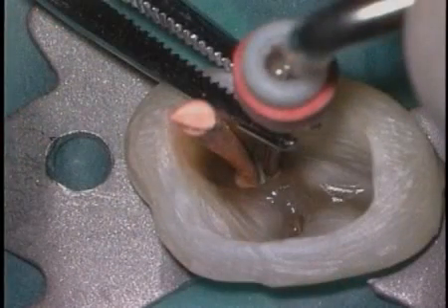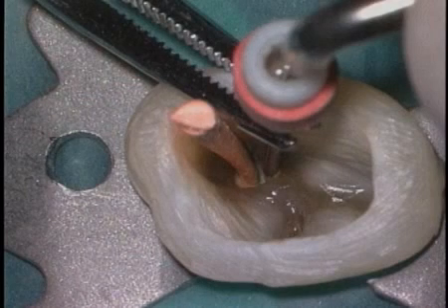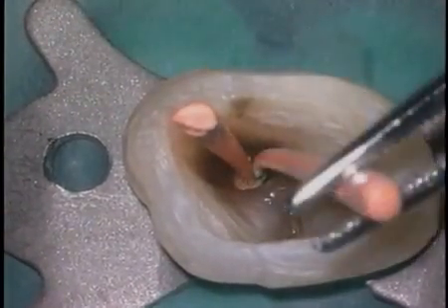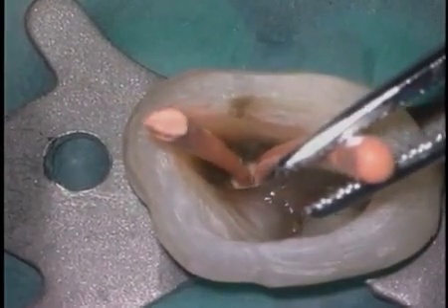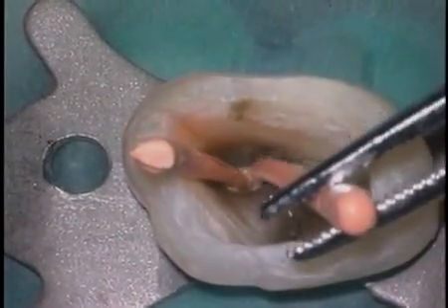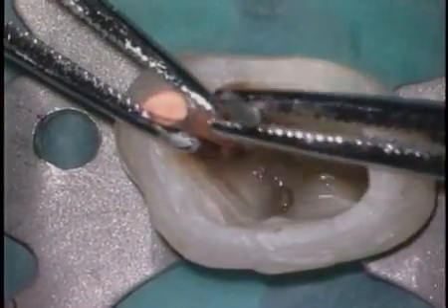Small hand files are used to tediously negotiate and secure the full length of the canal. A secured canal can be shaped, and a master cone serves to hold its position in preparation for the introduction of MTA. The MTA typically, when it's introduced, will be just the right consistency, but when it gets into the moisture, it can become too runny. So we may have to add direct powder of MTA into the canal to get that cake-like consistency, which means we can begin to move the material with more control.